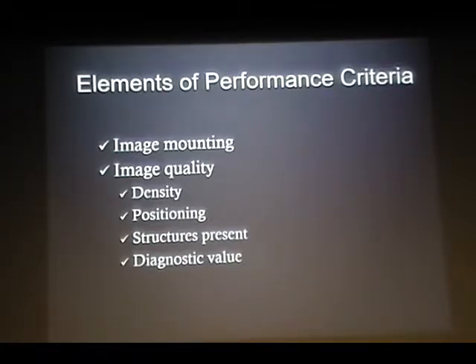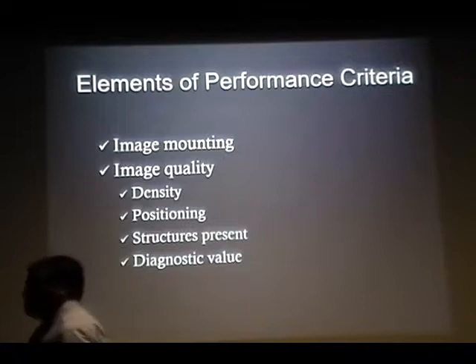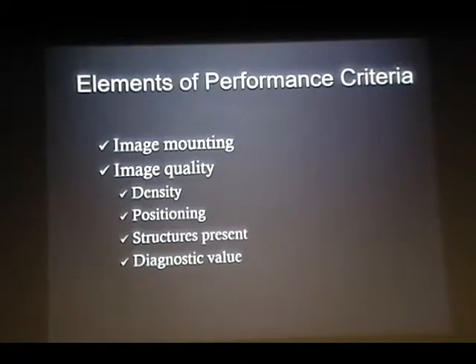And then positioning. Do I see all the teeth? There were some clinically challenging cases. In those cases, you may not be able to capture the teeth, but at least can I see them in a different view? Is it acceptable? Then I would say, okay, fine, clinically it is acceptable. You can pass. Actually, I don't understand the word density in this context.